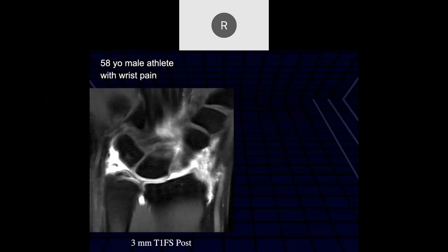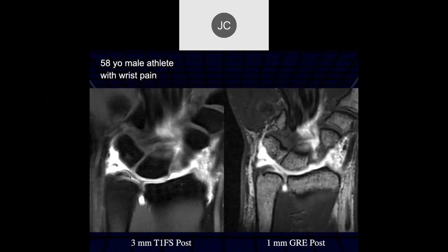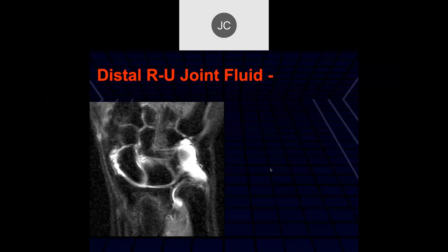I think we ended on this study before where we can see the increased signal intensity within the TFCC — gradient echo, thin-cut gradient echo showing the tear.